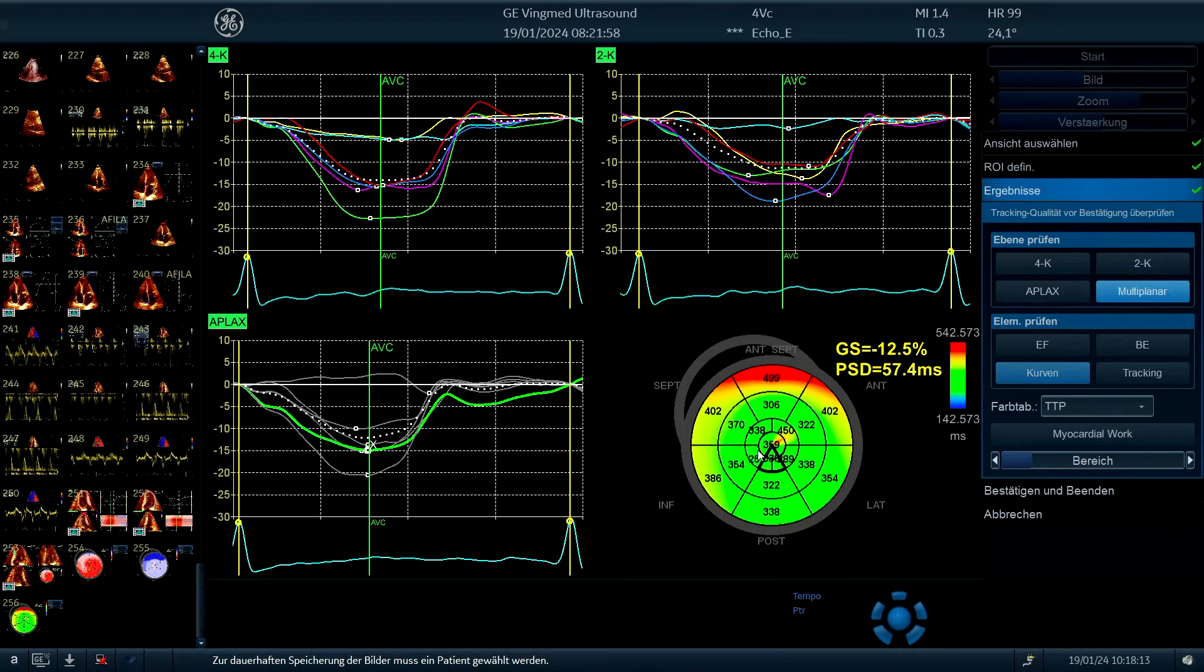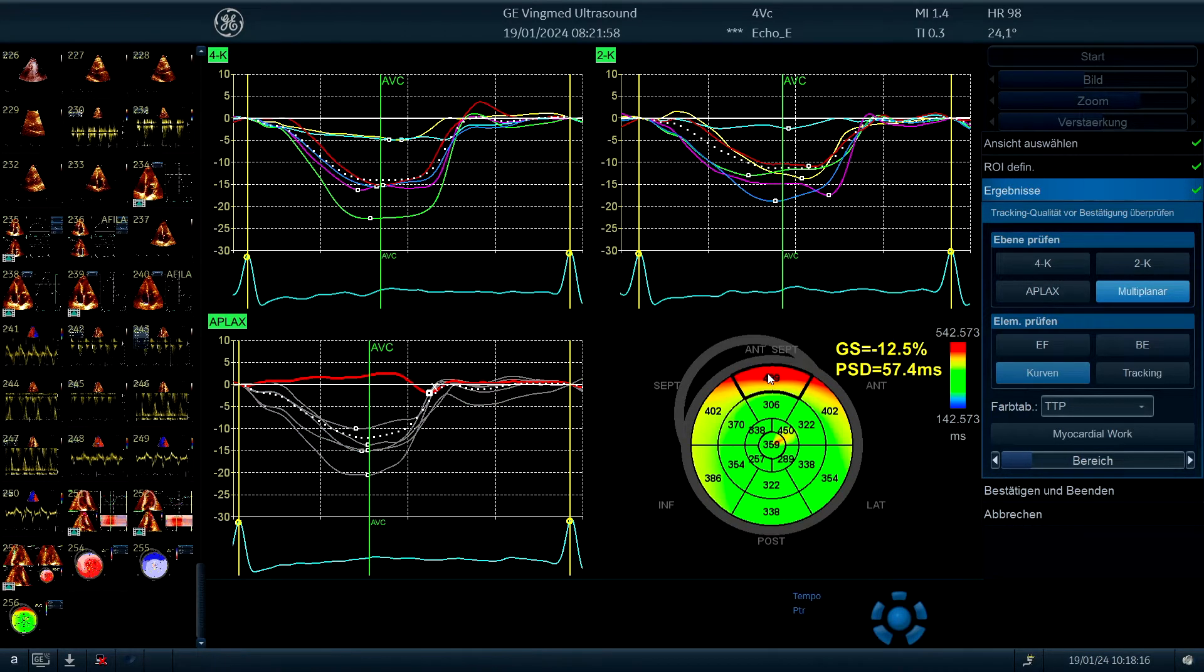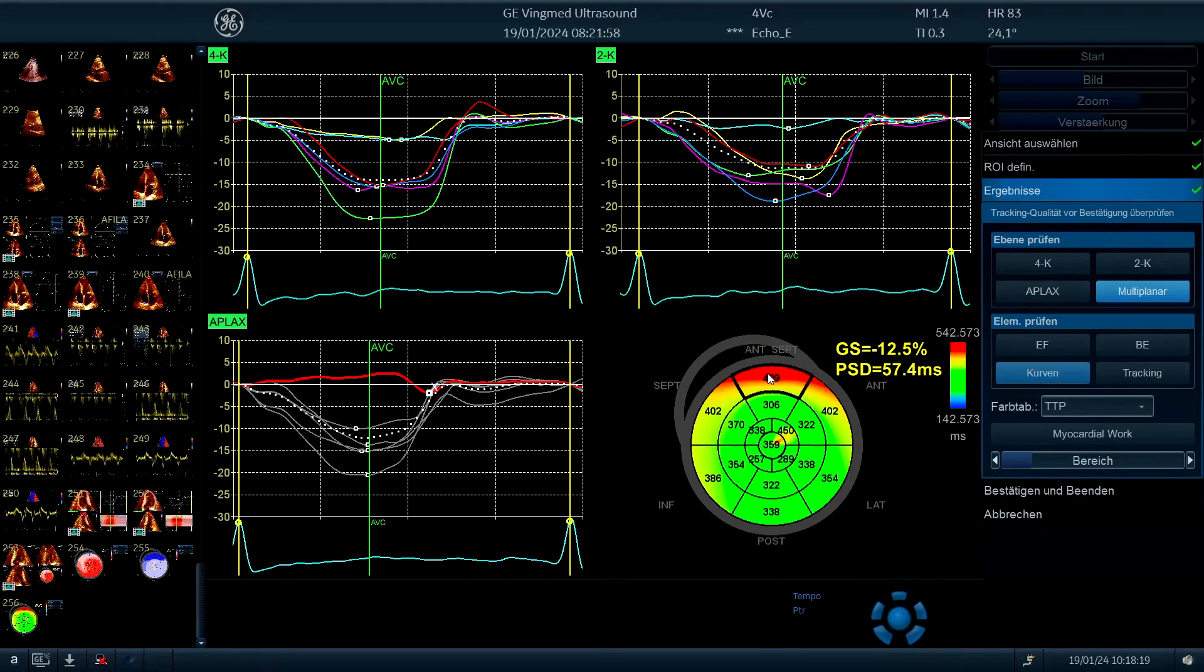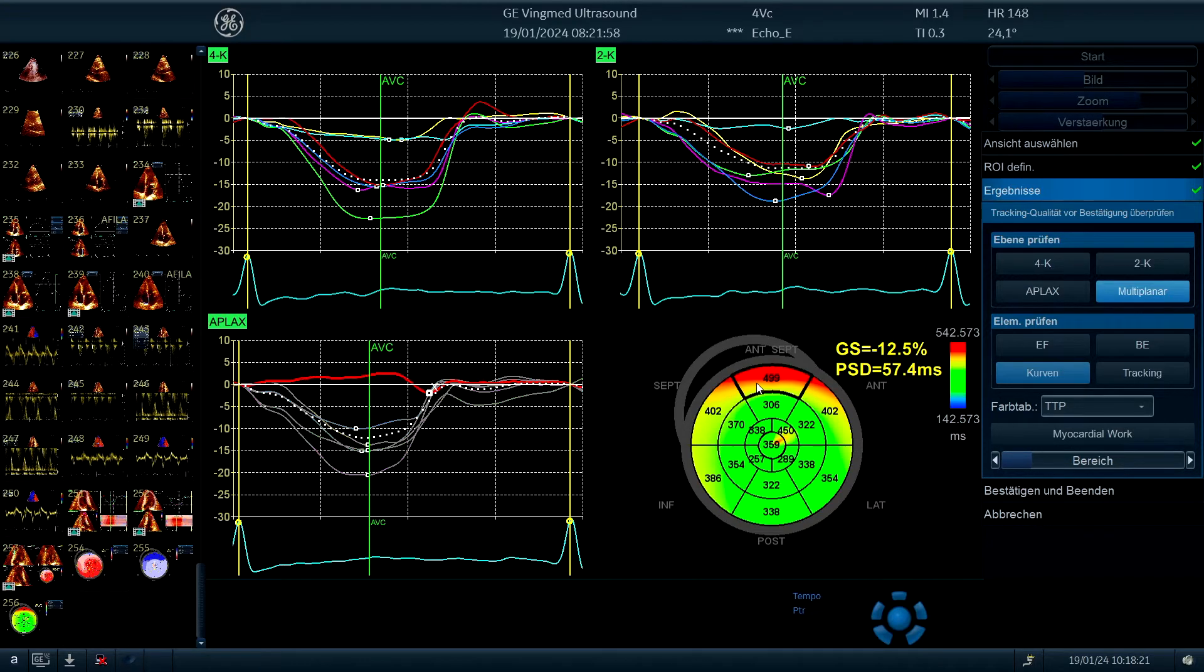this is the aortic valve closure, but there are some which differ. And here you can see the post-systolic shortening we have in this curve at the apical long axis view, the basal anterior septal segment.